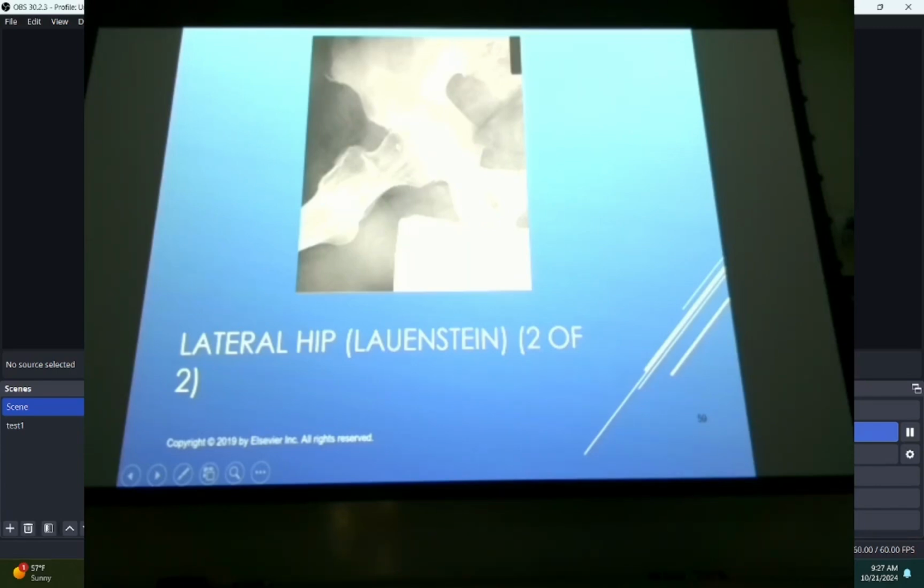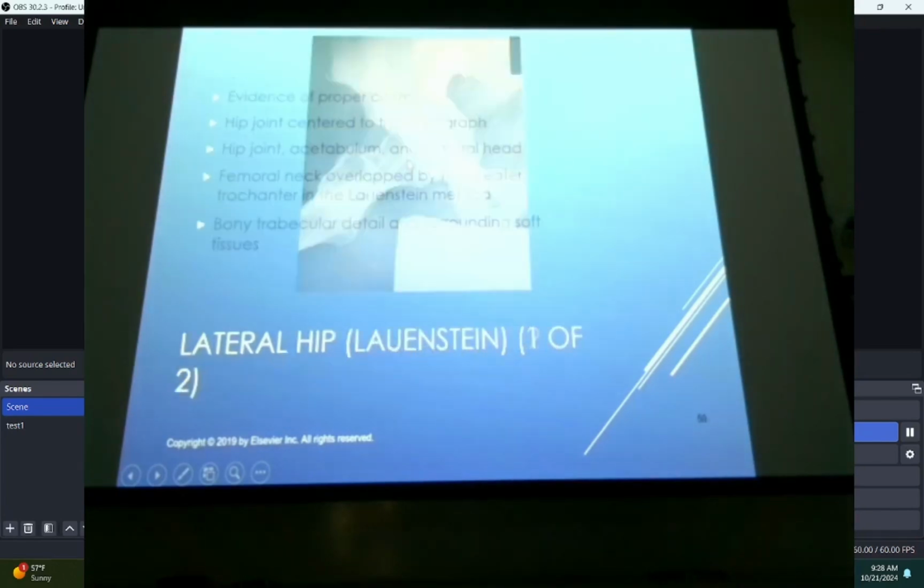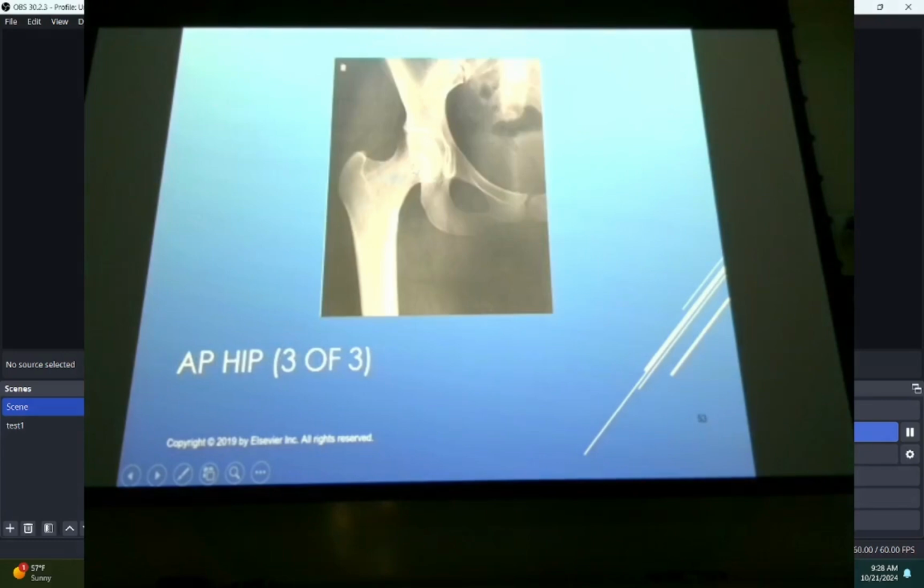In your frog leg, you might not be centered over that radiation detector. So what you might do is, for the AP, if you position properly and you got a good exposure, your index number looks good, you might turn the phototimers off and use the technique that the AP shot with. Pay attention to what it shoots with.